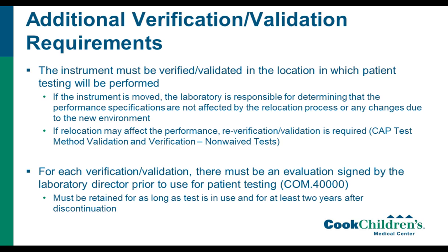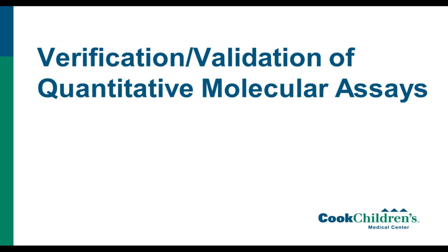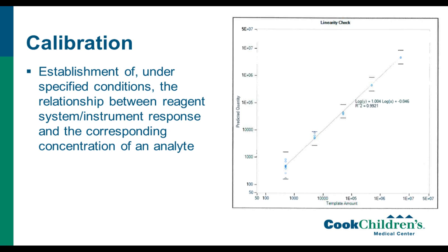So those are the general requirements and overview as far as verification validation. But let's move into more specifically discussing verification validation of quantitative molecular assays. So step one is calibration. Once you've decided on the assay and the platform that you're going to use, you want to do calibration.